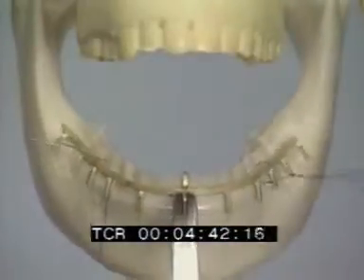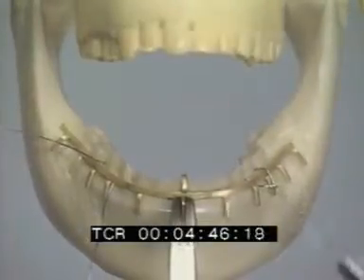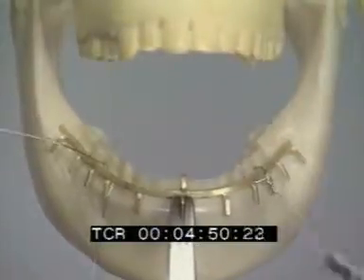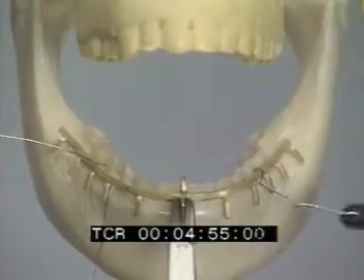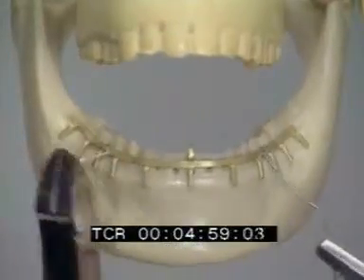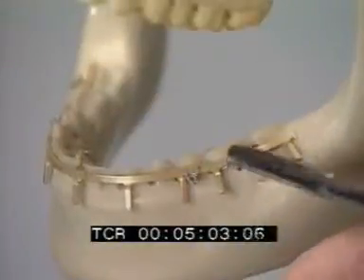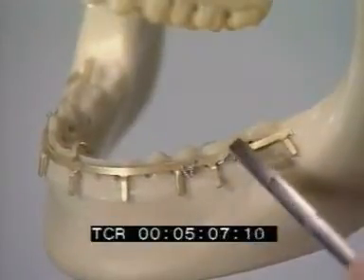In the premolar and molar regions, one end of the wire is above the arch bar and the other end below it. The wire is cut with the wire cutter. The wire ends are turned away from the gingiva to prevent damage.